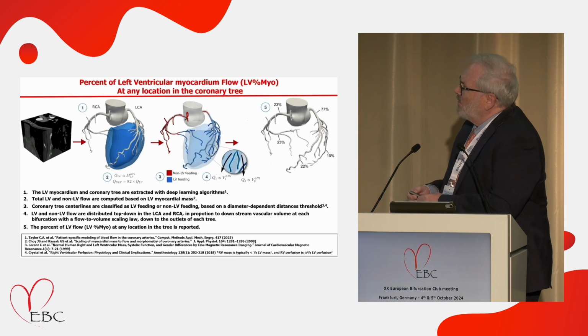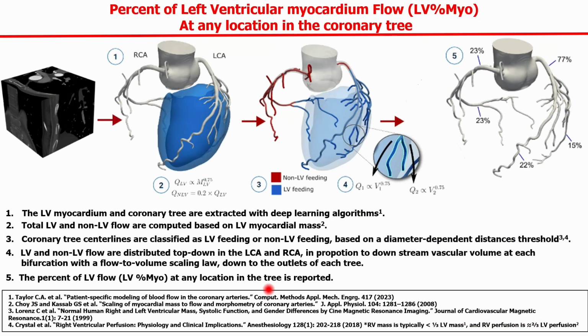Now, this is a complex slide. At the bottom, you have the whole literature, so you can read if you want. It's basically the technique of percent left ventricular myocardium flow. We call that LV percent myo, not to be confused with the nomenclature of the PET.